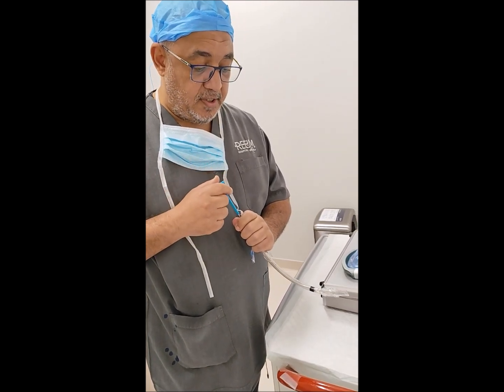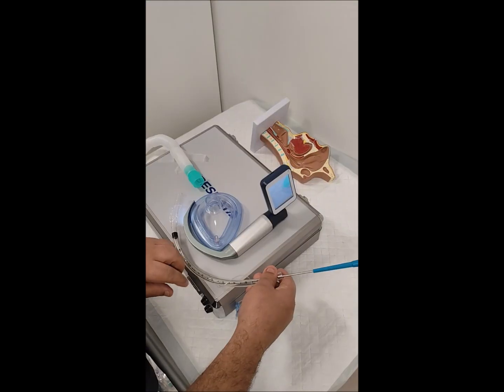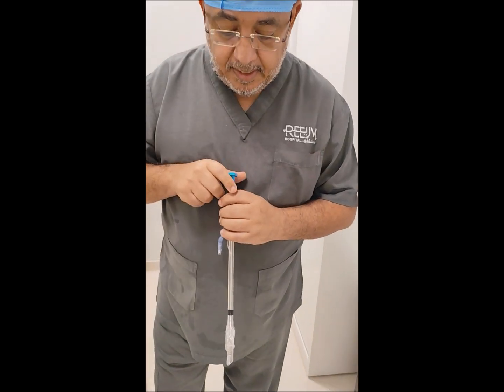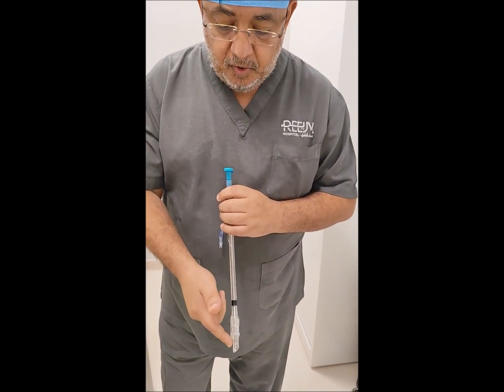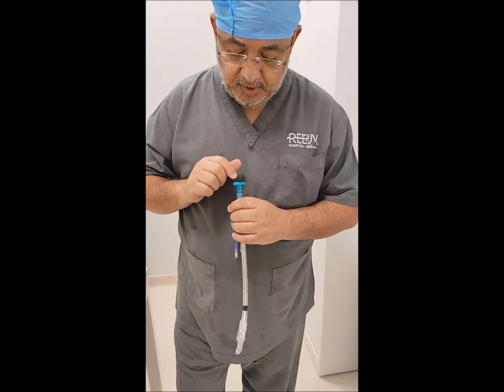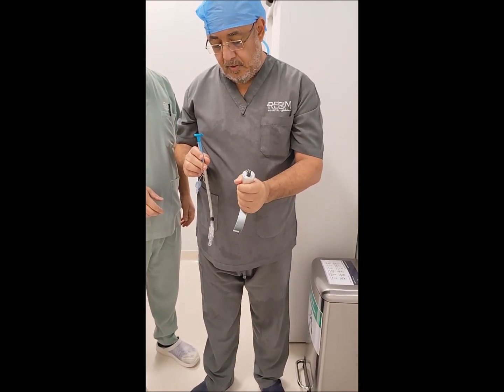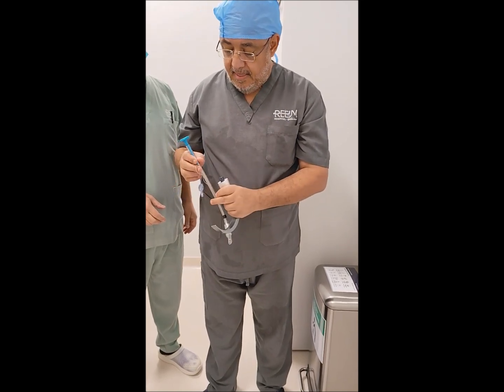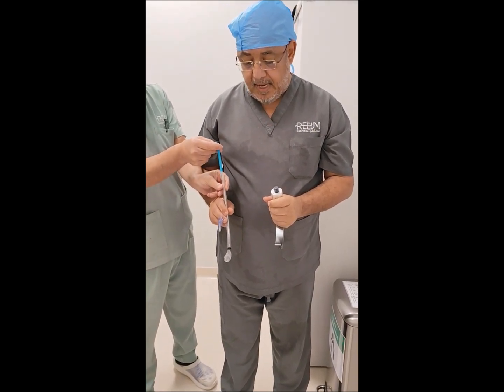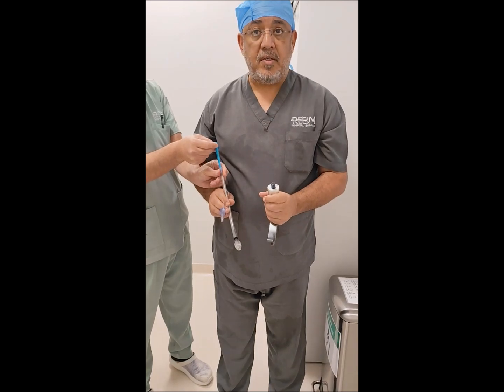Outside the body you can adjust the tip height as much as you need because you have the space. But when you put it inside the body, the tube is moving but you cannot get the required height. One advantage of the stylet is that you can use it to guide the tip of the tube right or left by moving it accordingly. However, the stylet needs a third hand — the anesthesia doctor uses the glidescope with the left hand and the tube with the right hand, while the assistant moves the stylet up, down, right, and left to adjust the tip to the larynx.